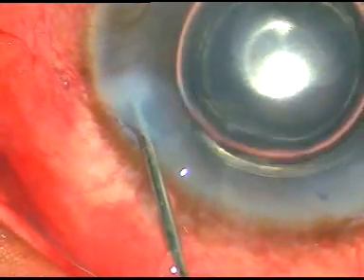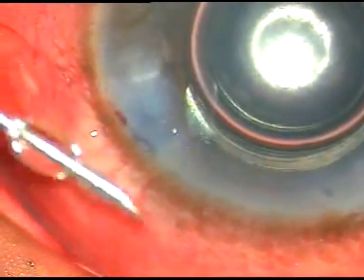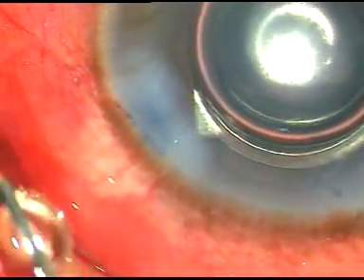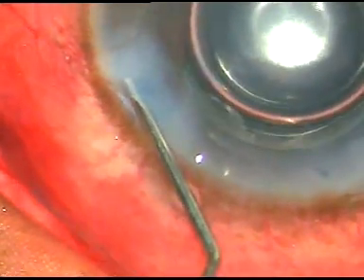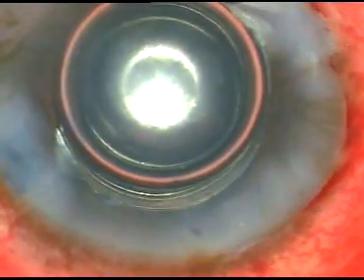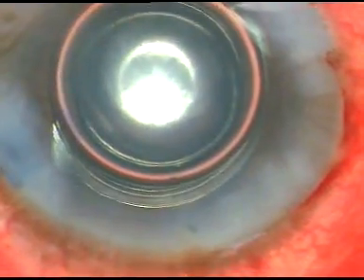The side ports are hydrated. And now this is the final wash.